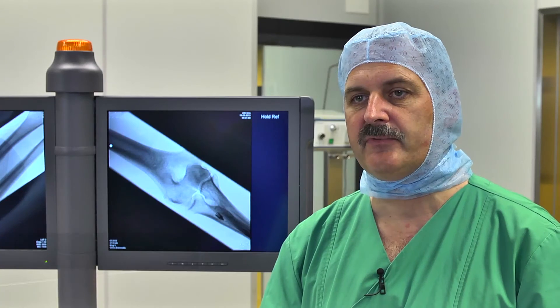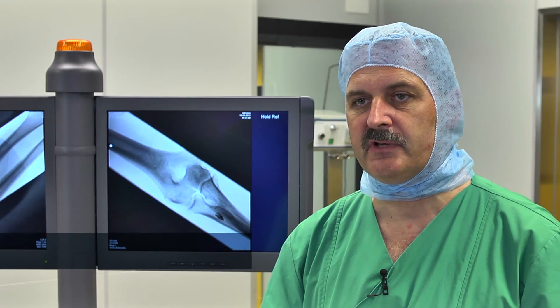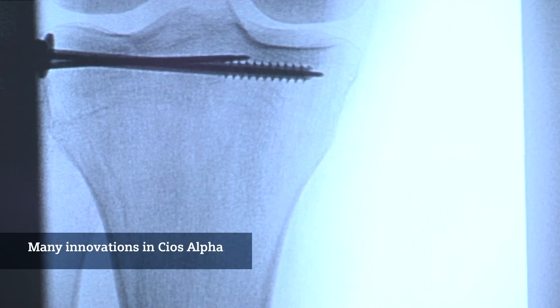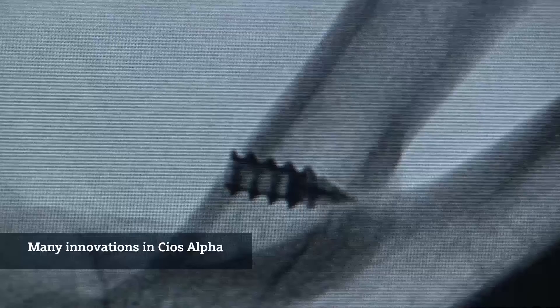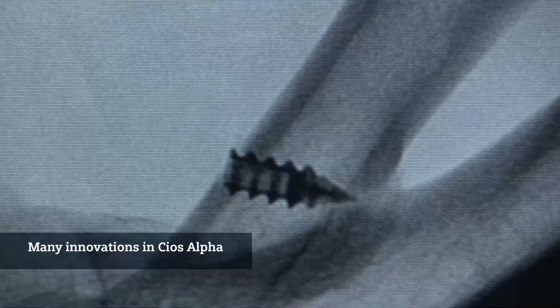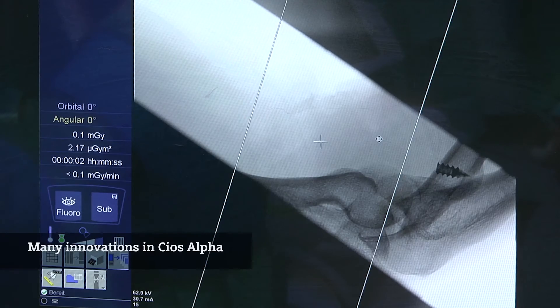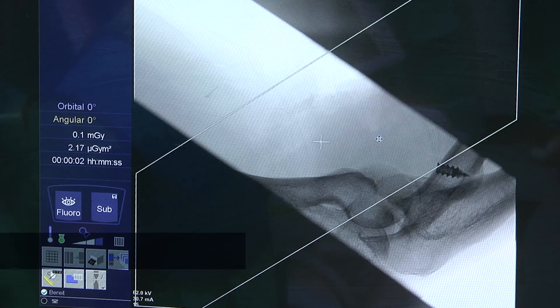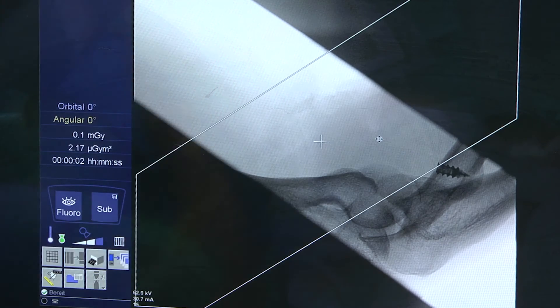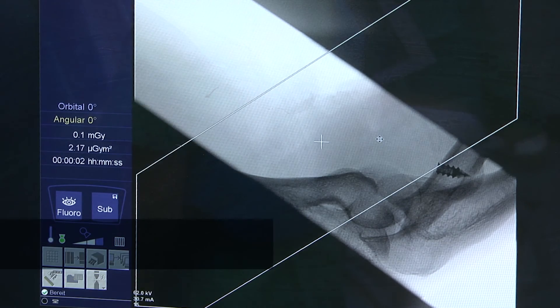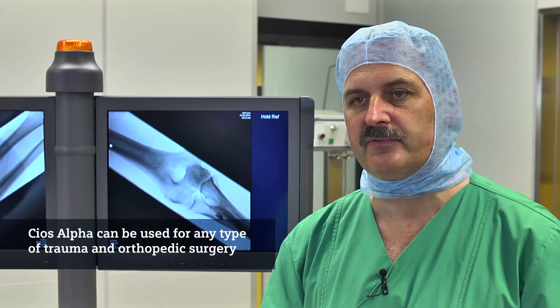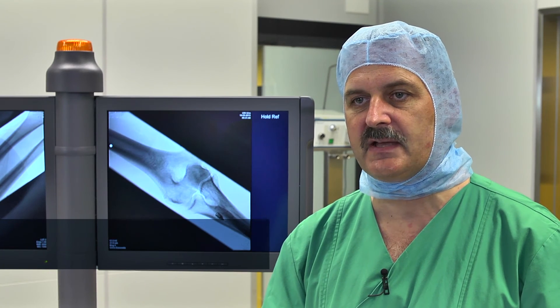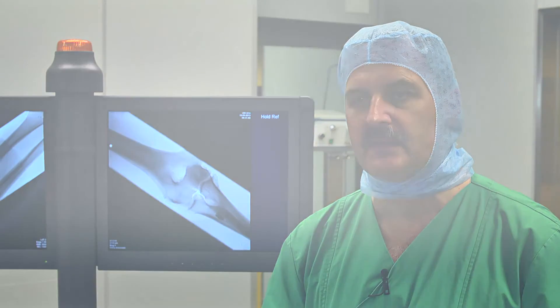Any type of surgery where you can rely on 2D images — with all the improvements of the system, better image quality, larger field of view, collimator system, and rotating images — you can address any type of trauma surgery or orthopedic surgery with that C-arm.